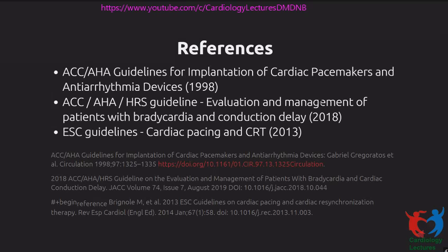You can start with His bundle. If you don't get it, you can just go to the left bundle region. Or if you go with the left bundle, you can come back to the His bundle. So it's not a choice that you have to make upfront. Having said that, His bundle pacing has more evidence now in terms of number of cases done and number of years that it has been done, whereas left bundle pacing is newer.